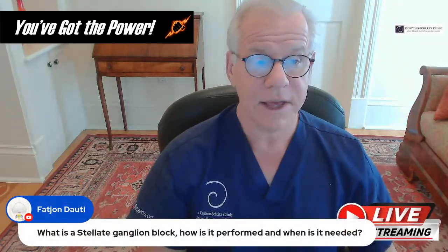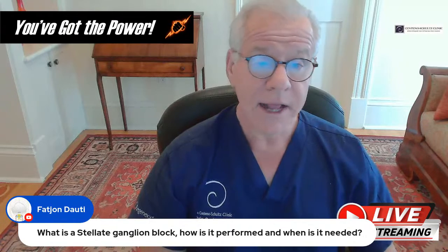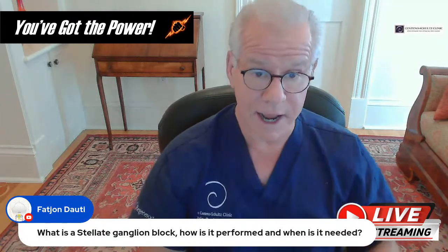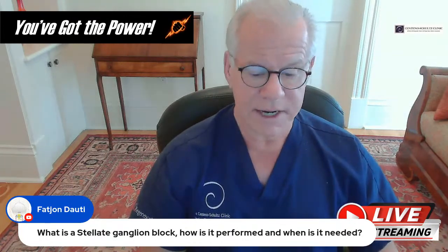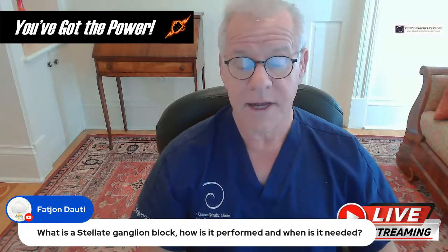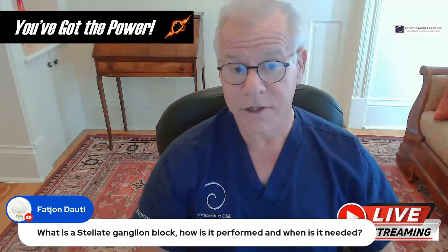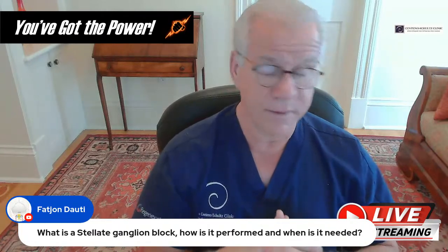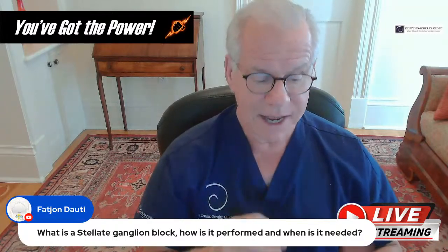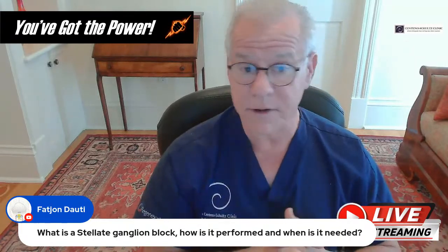What is the stellate ganglion block? How is it performed and when is it needed? Stellate ganglion block is a block of the sympathetic ganglion in the neck. And when is it needed? They became very, very popular of late in military patients who had PTSD, post-traumatic stress disorder. They would do a stellate ganglion block, which basically gets rid of the fight or flight response because the signals would go through there.